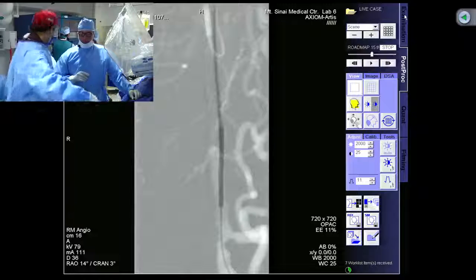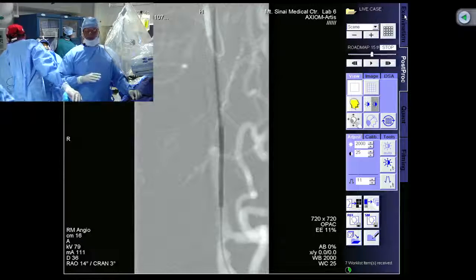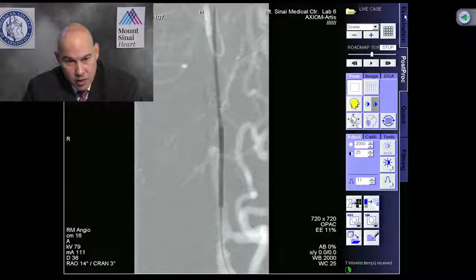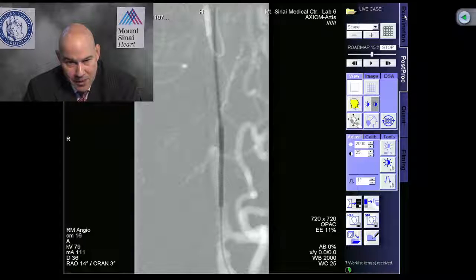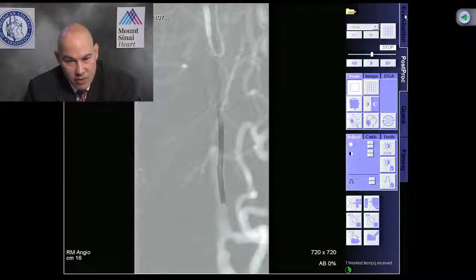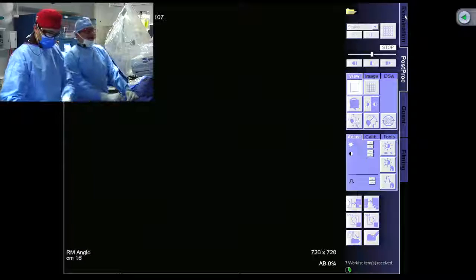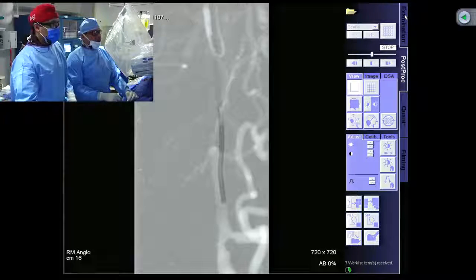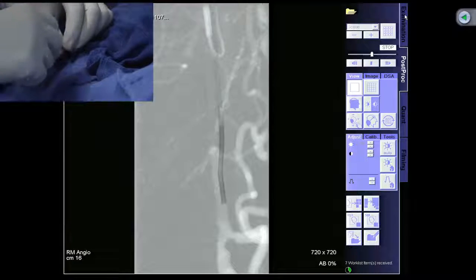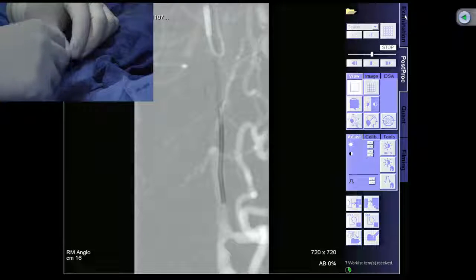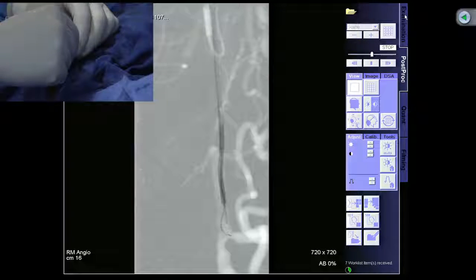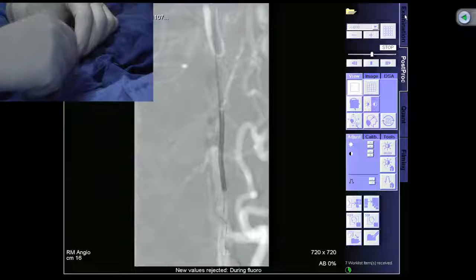The concept is clear: if you keep aggressively advancing this wire you will get through. There's no special skill — the key is understanding the theory. You want to limit the area you treat to the diseased segment only. If you advance into the popliteal and leave a dissection, you'll be tempted to stent it. Being cognizant of your treatment zone avoids that. I knew I was treating up to this point because you can see a significant SFA stenosis here.